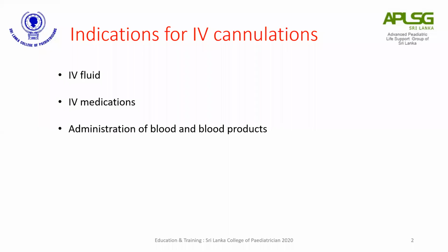It may be to give IV fluids. Maybe it's a collapse patient, or you may have to correct dehydration, or it may be a patient who is unable to tolerate orally. Then for administration of blood and blood products, and also for IV medication, intravenous access is needed.